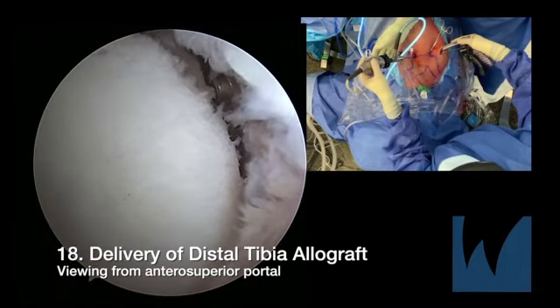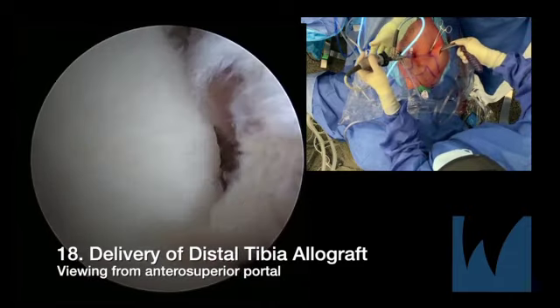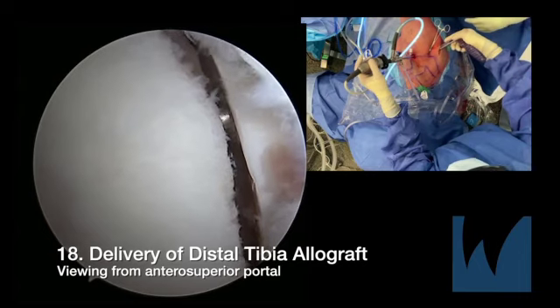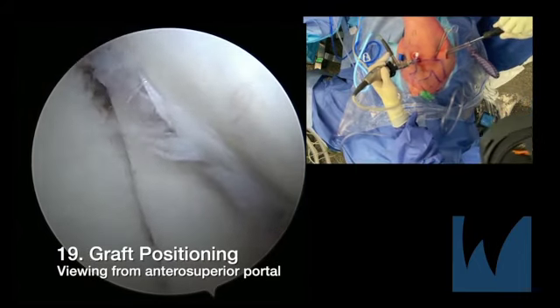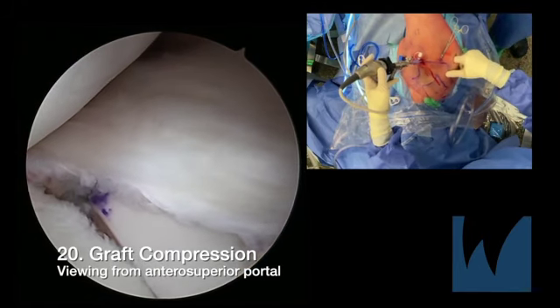Viewing from the anterior superior portal, insert the graft through the posterior portal using the half pipes as guides to the dilated posterior portal. Position the graft flush against the native glenoid by using the double-barreled cannula to maneuver. Confirm that there is no step off from the native glenoid to the distal tibia allograft such that there is a flat articular surface reconstructed.